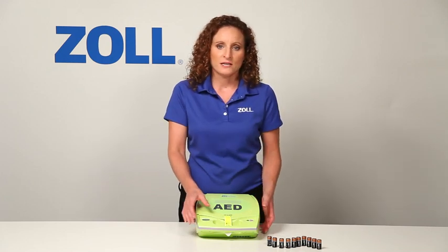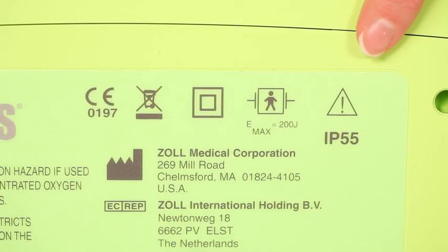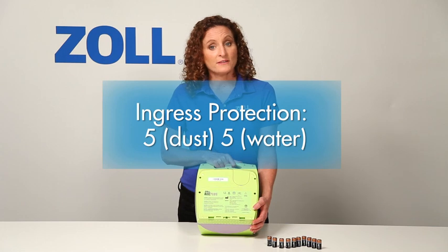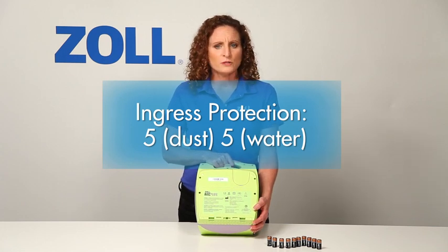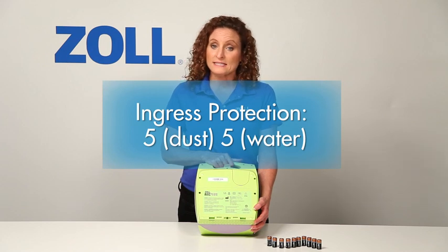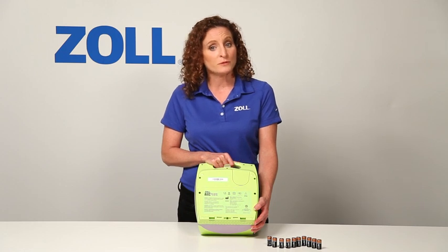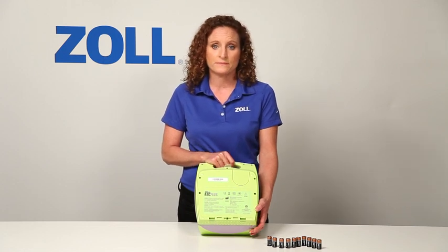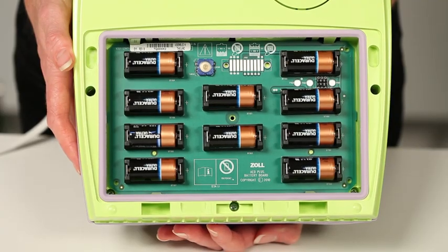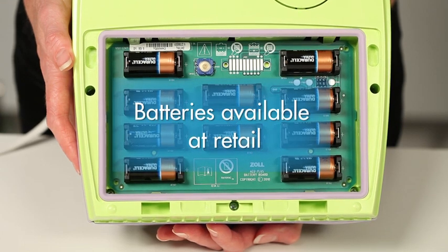Let me review a few other features of the AED Plus. Notice that the door to the battery compartment has IP55 printed on it. The ingress protection rating is 5 for particles, meaning it's protected from dust, and 5 for water, meaning it can withstand spraying jets of water. Very few AEDs on the market today are this well protected against harm from dust and water. The AED Plus is powered by 10 123A lithium batteries, which you can purchase at retail — for example, from any camera store.